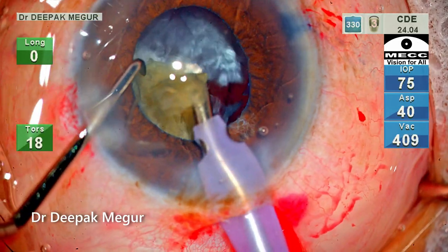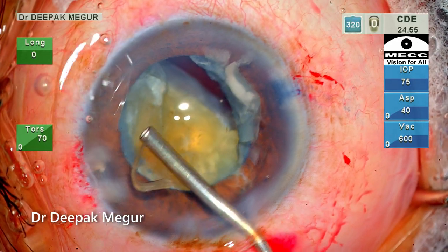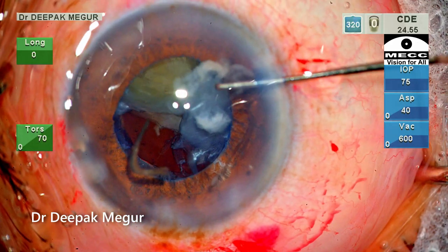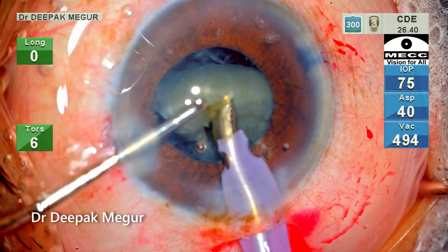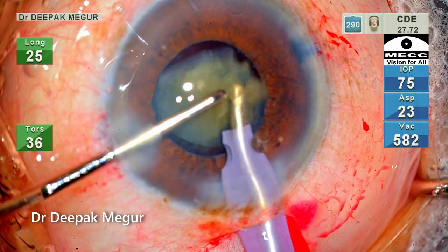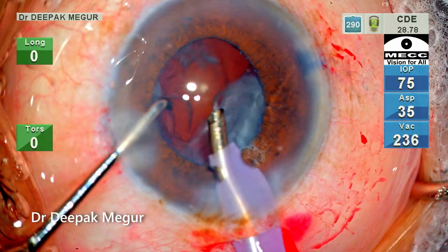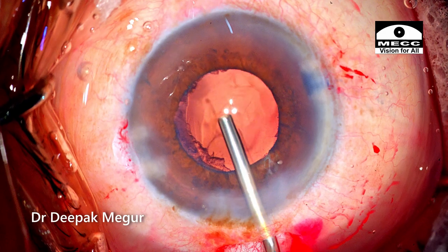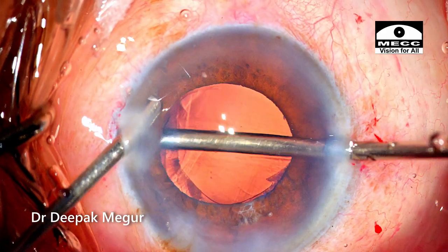OVD is again being replenished. Just checking that everything is alright by just moving the nucleus around with my Sinskey hook. The final piece is again divided into two pieces and then consumed, followed by epinucleus aspiration. I fill the bag with OVD before starting to aspirate the cortex.